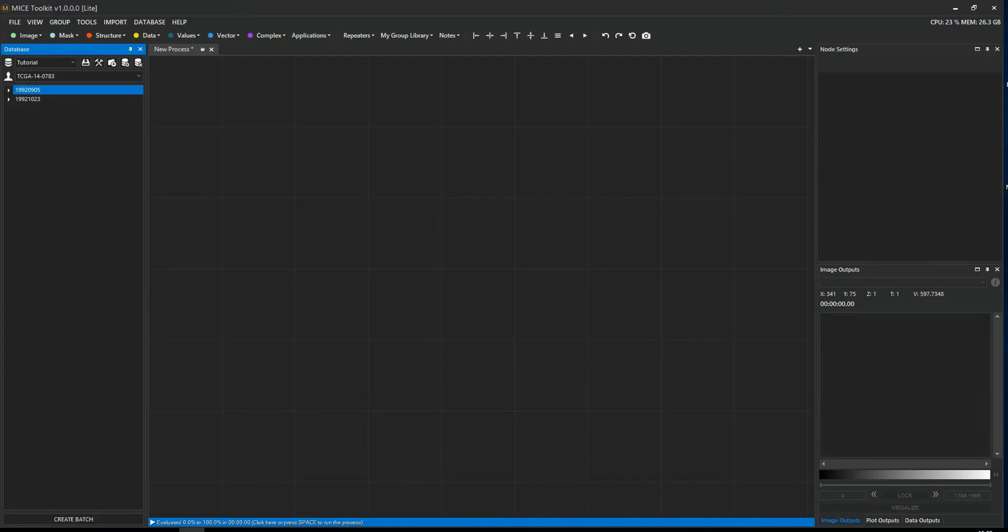Hello, and welcome to this tutorial in MICE Toolkit. In this video, I want to show you how to work with MICE Toolkit. I want to show you how to create your first workflow, and I want to show you how to view the result and save the result to disk.